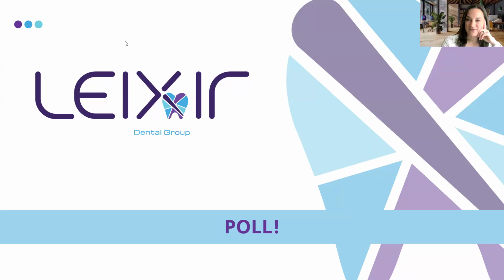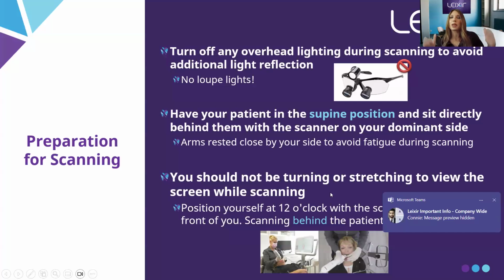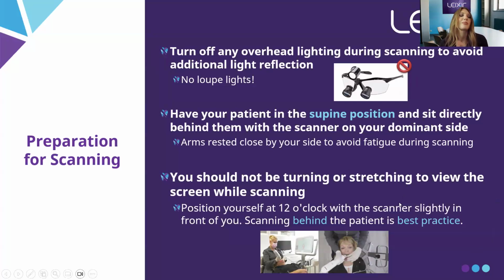Awesome. Thanks, Emily. All right, let's see. Now, there we go. All right. So we went through the prescription. Now preparing for scanning. So just a reminder, this goes for anytime you scan intraorally.